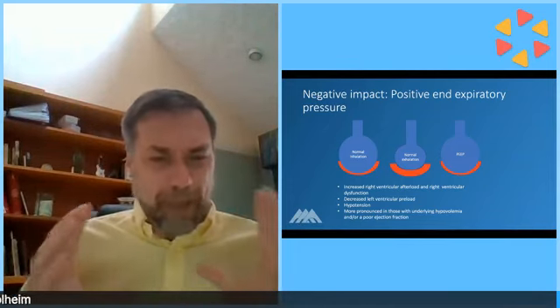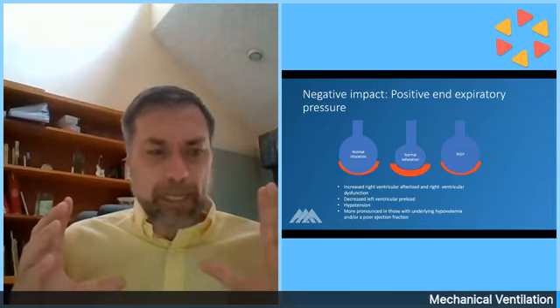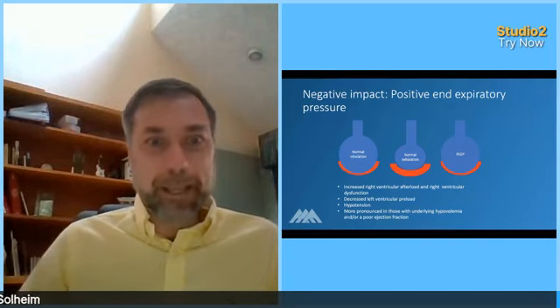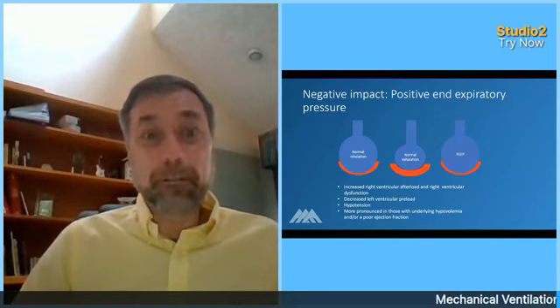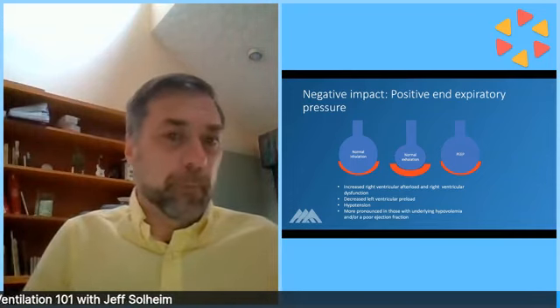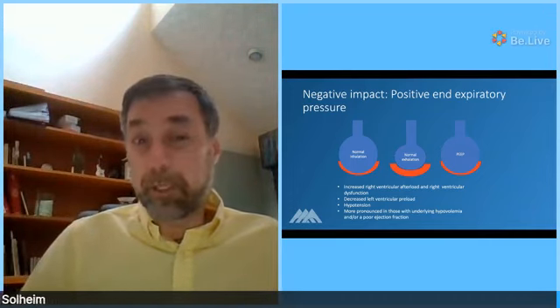Okay. So you have a patient who you intubate initially, right? You're going to intubate them, and then you're going to put them on an FiO2 of what? If you just intubated them because they were circling the drain, you're going to start the FiO2 at 100, right? Because you just intubated somebody. So we're going to put the FiO2 at 100. Hopefully, that's going to cause a lot of oxygen to cross the alveolar membrane and flood the hemoglobin so that you can increase your patient's PaO2, and then get the oxygen to the tissue.